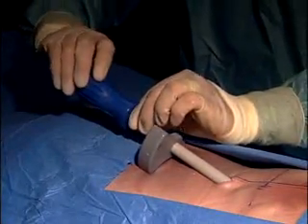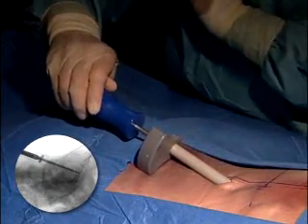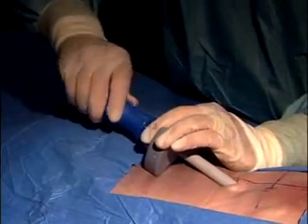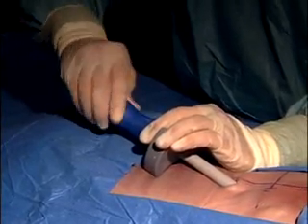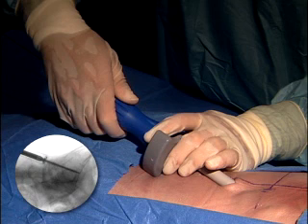The placement of the implant should be with a continuous forward clockwise motion, using a series of fluoroscopy images to ensure proper depth. Do not pull back on the driver when inserting the implant. This may disengage the implant from the driver, which could cause the premature advancement of the compression collar of the implant. The 4.5 mm bone lock PLS implant is inserted until the distal tip is at the desired location, leaving the proximal head of the implant slightly proud to allow for compression.